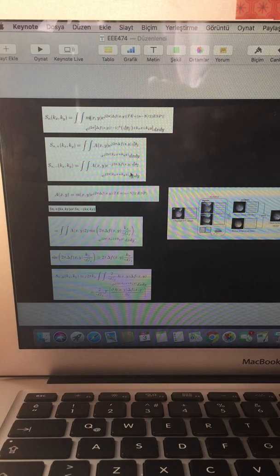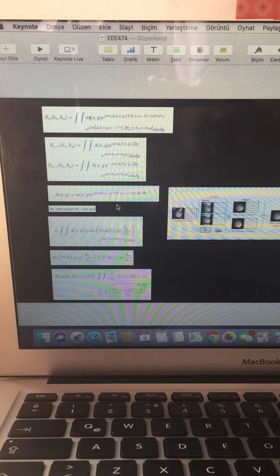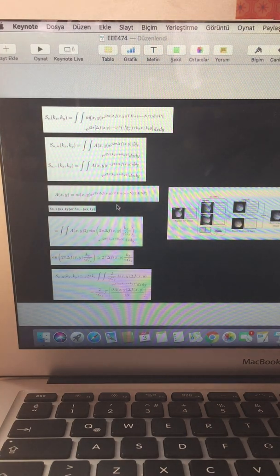Two sets of k-space are created, and the now formed even and odd signals can be declared like that, and then we can get rid of the ghost artifacts. Even and odd signals are subtracted, and this term could be changed into a sign term, like in equation 4.